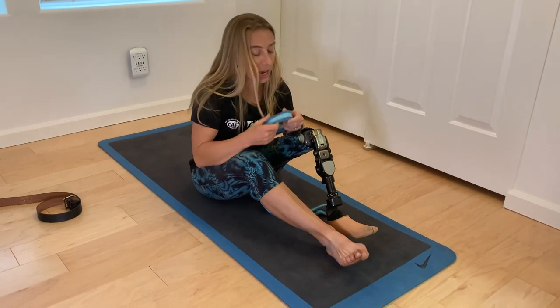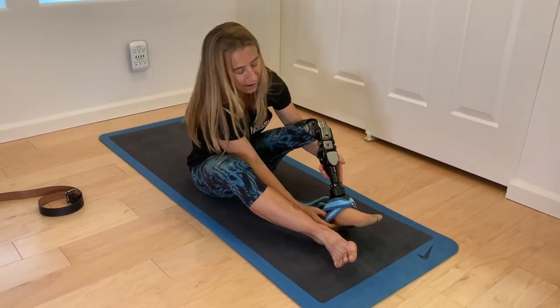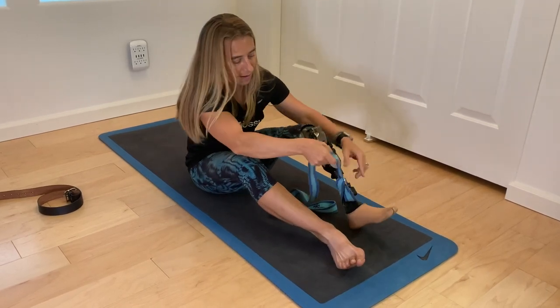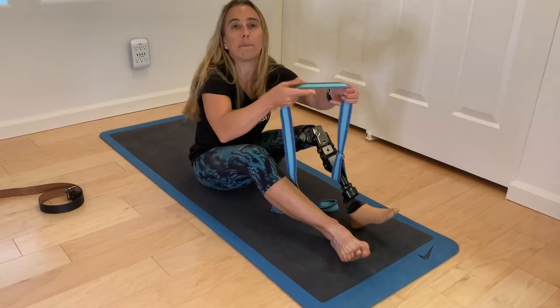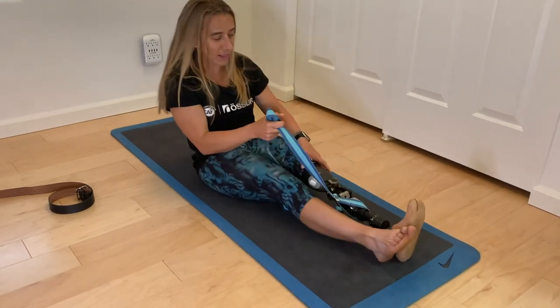So for this stretch, I'm actually going to take the strap and put it on my prosthetic right now. I'm going to take it over the foot and have it ready just kind of by the ankle. Don't need to make it super tight, but it's ready there for when we do our stretch. So now we're going to do the hip flexors.